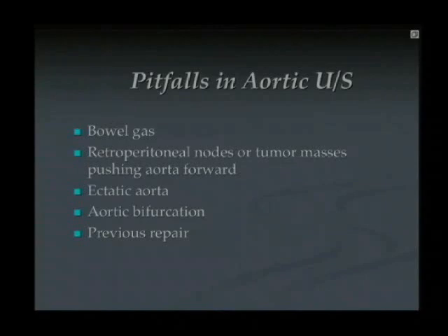Make sure you see the entire aorta. That's the thing about the bifurcation, all the way down to the bifurcation. Yes, another question in the back.